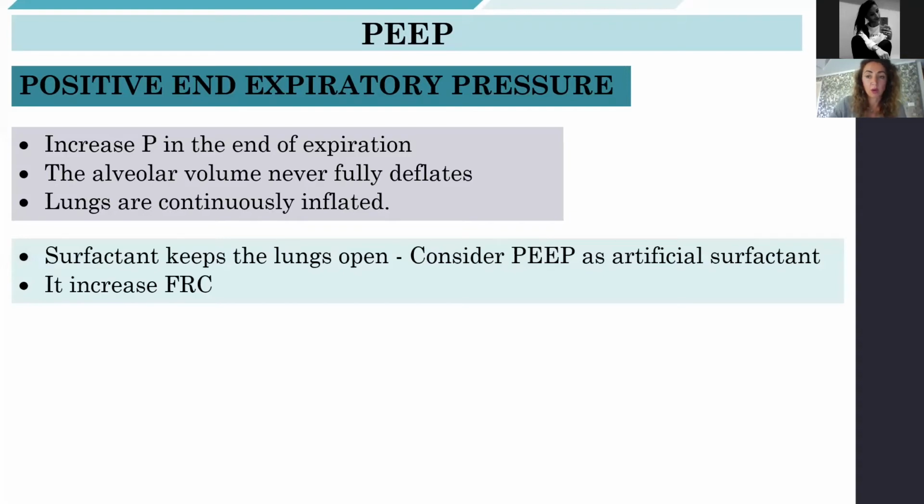Whether or not this is the action which will cause the PCO2 to fall is not known, but since it works, it's better if you are using it. There is the use of super PEEP and mega PEEP, which is 20 or 30 centimeters, but in clinical medicine those are extremely hard oxygenation cases and usually they have really poor outcomes.